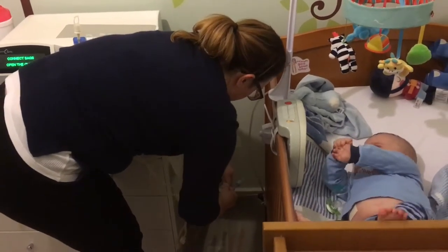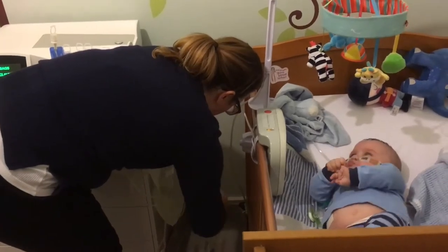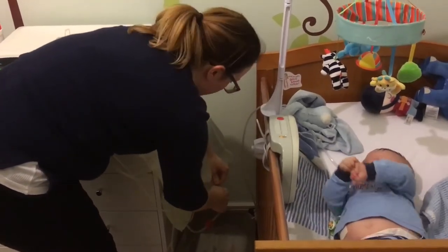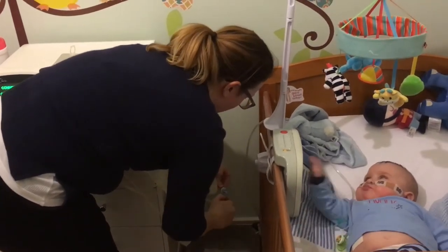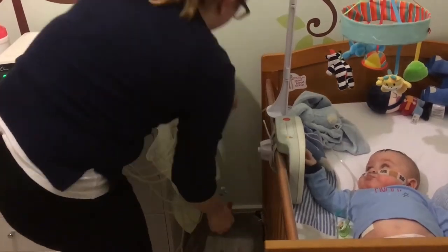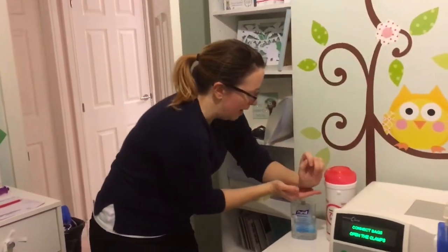That's Ethan, just to be clear. So that's the bag attached, and I open this clamp — break that seal, sorry — and open this clamp. So in between each section of the bag I have to put alcohol gel on again.